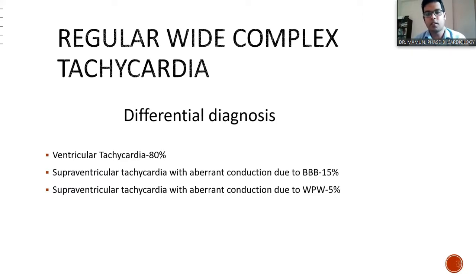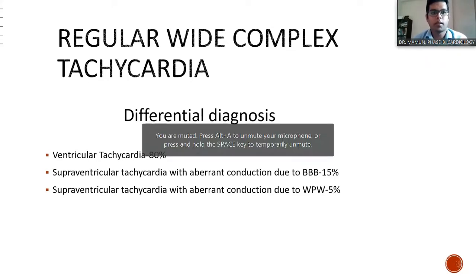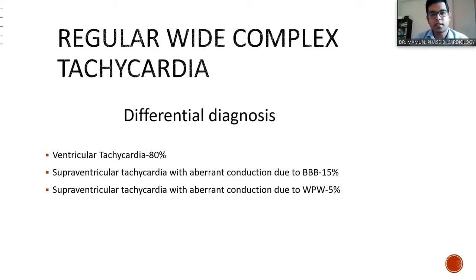Pacemaker-mediated tachycardia or tachycardia related to hyperkalemia or drugs. However, in wide complex tachycardia, when we are in diagnostic uncertainty, it is wise to manage the wide complex tachycardia as VT. The default diagnosis must be VT.